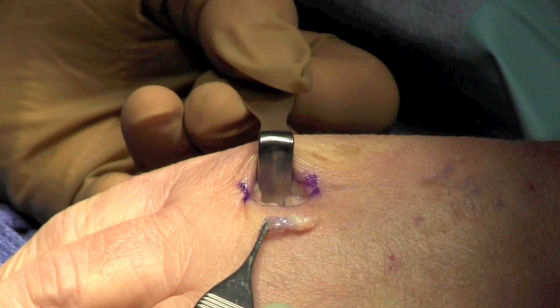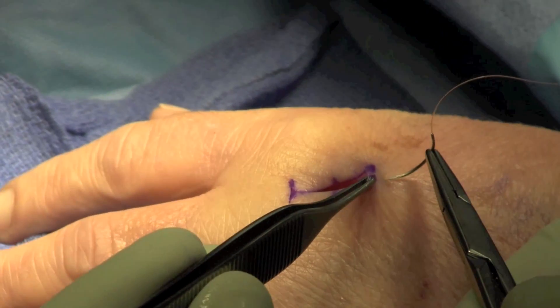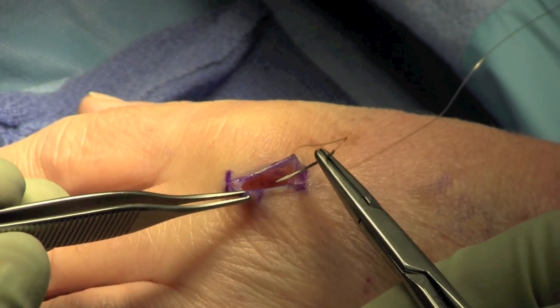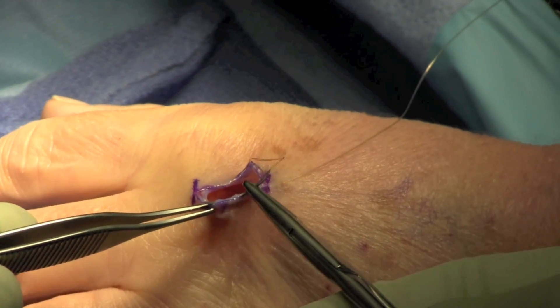The mass is removed and sent for pathology, and the wound is irrigated and closed using absorbable sutures in a running fashion. The patient is allowed to begin immediate range of motion as sterile dressing is applied.